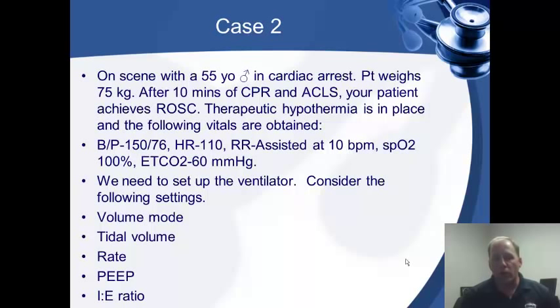What strategy are we going to use, first of all? We're going to use the lung injury strategy. This patient's not obstructed, but just an ROSC, so this setting should be fairly easy. Most of the default settings on our vent should work fine.